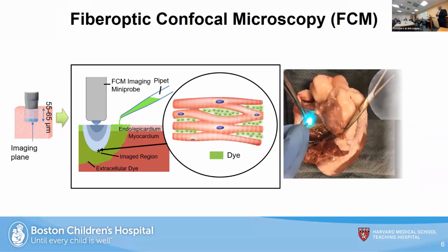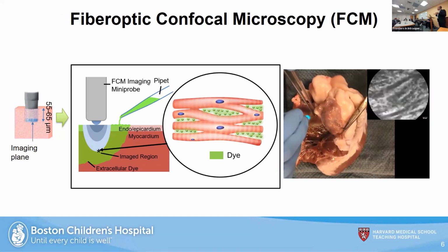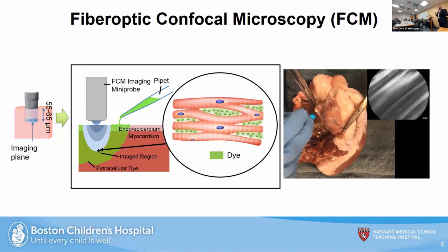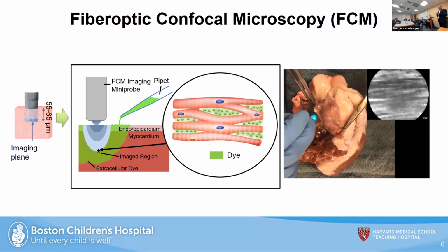Since we use a hydrophilic dye, it usually stays in the extracellular space and lights up the boundaries, revealing the microstructure. Using that, an external user can identify whether the structure we are seeing in the myocardium is anisotropic or reticulated.